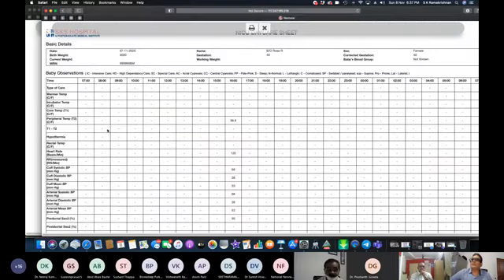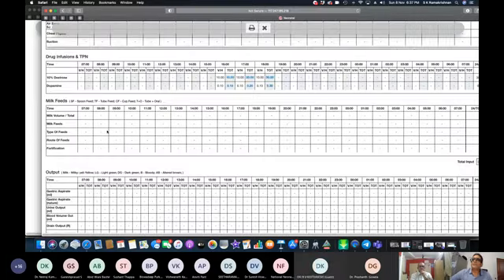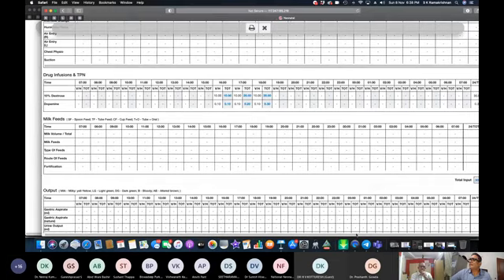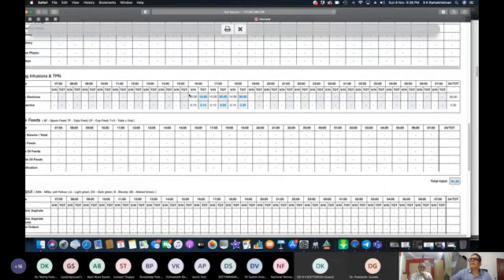This is the nursing chart, which Sushanth was telling. So instead of the handwritten one, with this technology, the dextrose is 10 ml per hour, this is a total, 10 ml per hour, then total 20 ml. So it captures the running total every hour. And then the dopamine 0.1 ml per hour, totally it has run for 3 hours and this is 0.3 ml. So all your input output charts automatically get calculated. So far in 3 hours, this baby has received 30.3 ml of fluids.